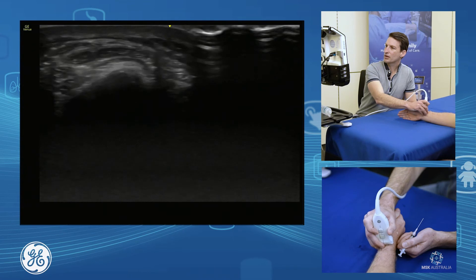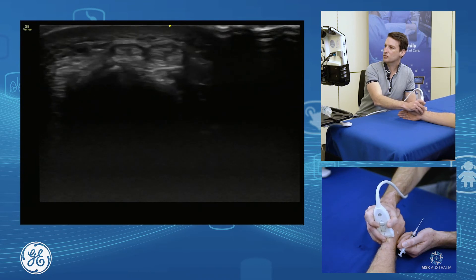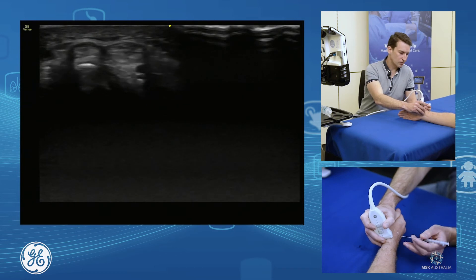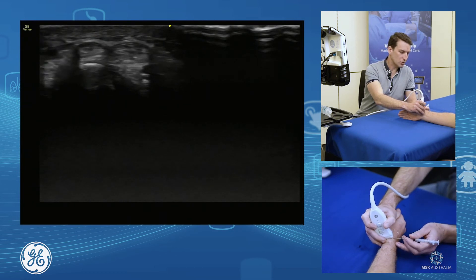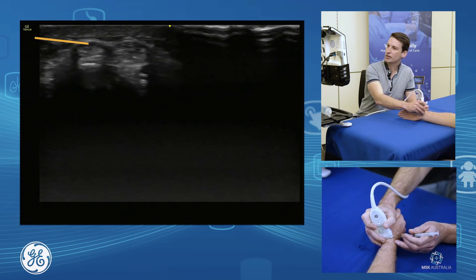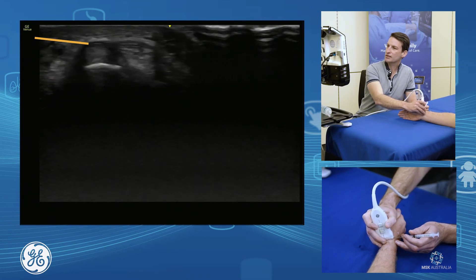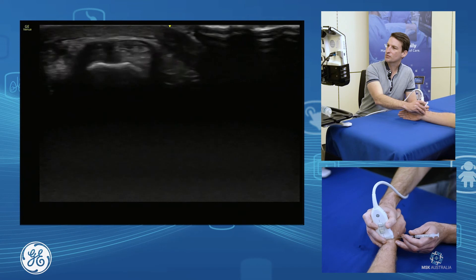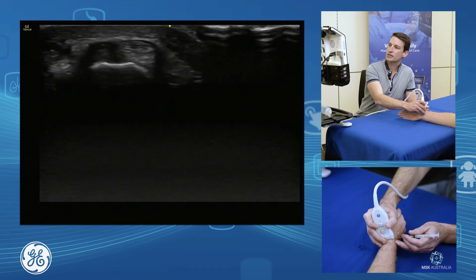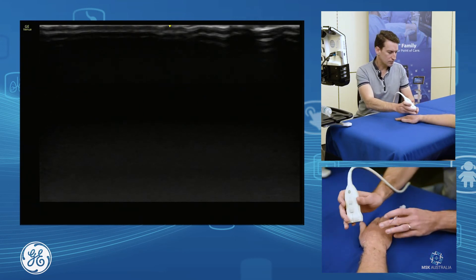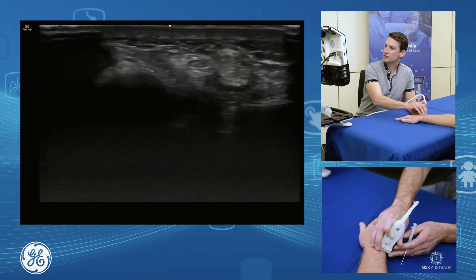What we do is find a nice plane to get into the tendon sheath, move across to one side, come down half a centimetre and straight in to guide the needle in. These tendons can sit in separate sheaths, so we want to be aware when injecting that the injectate is flowing around both tendons.